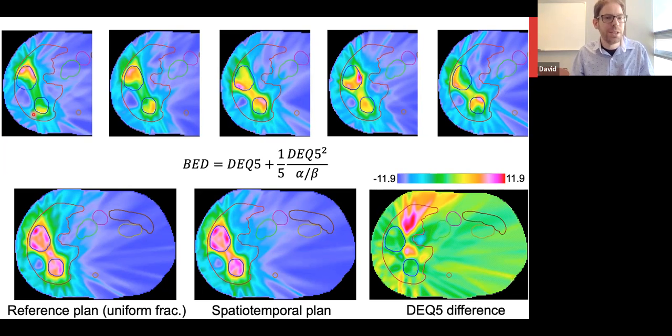This can only yield a benefit if you get these weird looking dose distributions, which are very dissimilar from each other, but might irradiate different parts of multiple lesions at the same time. But this way, it is possible to make all the healthy tissue doses look very similar, so that the healthy tissue sees an effectively uniformly fractionated treatment, even though the treatment is completely non-uniform.